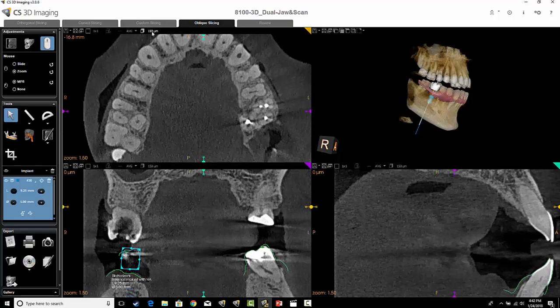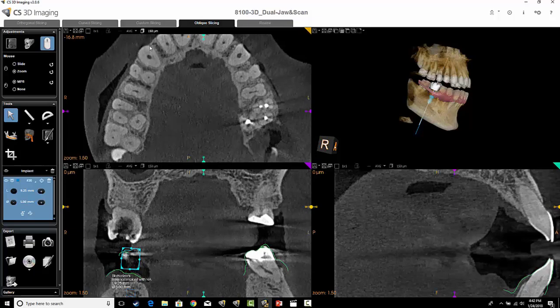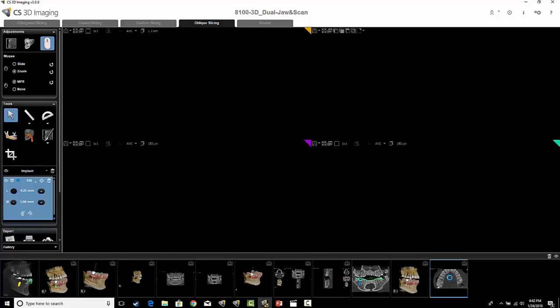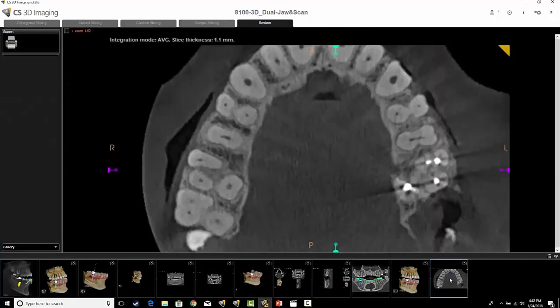Looking at the molar region and changing the slice thickness to 1.1 millimeters, you can see how that affects the image. Then you can take a screen capture and put it down into the gallery. Here is the resulting image, which can then be used in other applications.